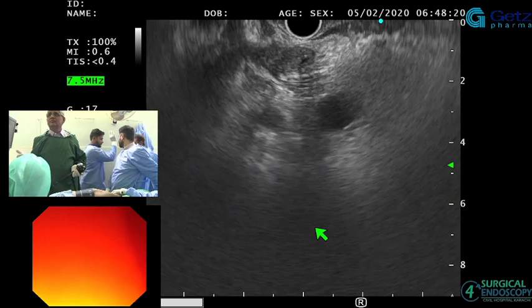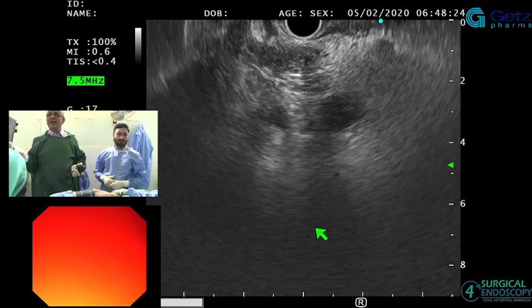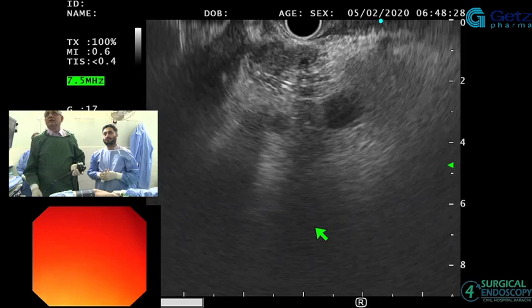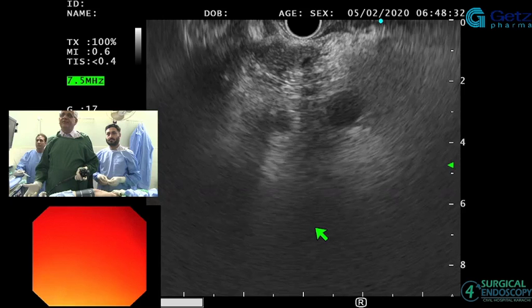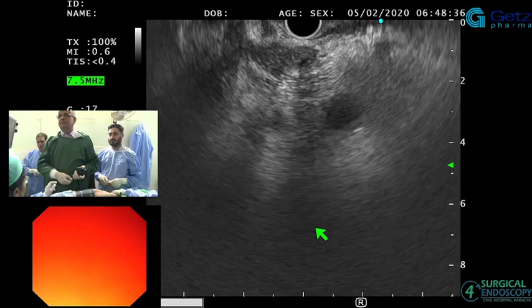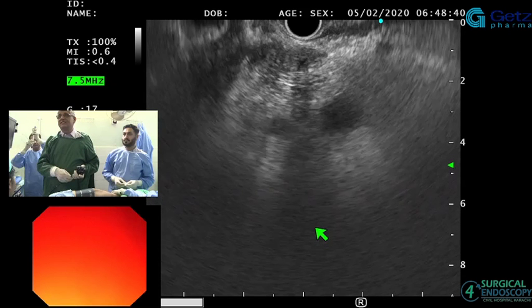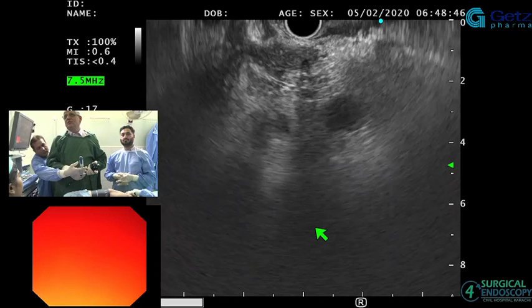Yeah, you look at the lesion, and if there is a need for FNA, or a need for doing an ERCP, you just do the ERCP then and there. EUS with FNA, FNB, whatever is required, first. If you see a mass or a lesion, then you do FNA or FNB. Right, thank you. For most good centers who have the facility available, they would go ahead and do an EUS first, immediately followed by ERCP.